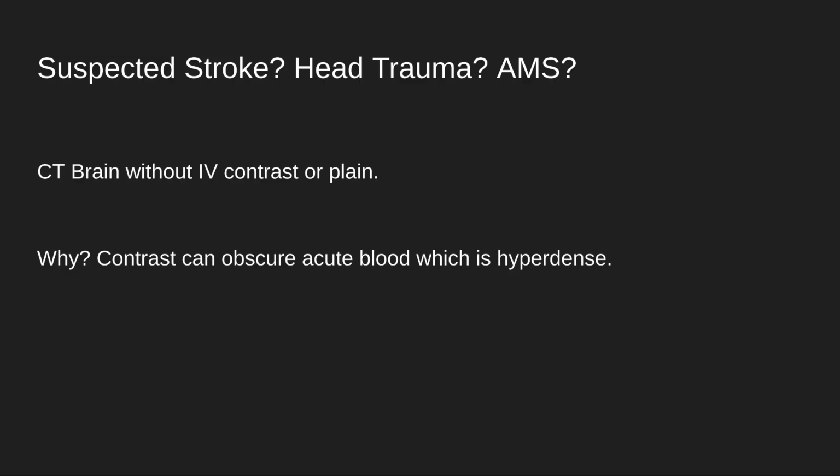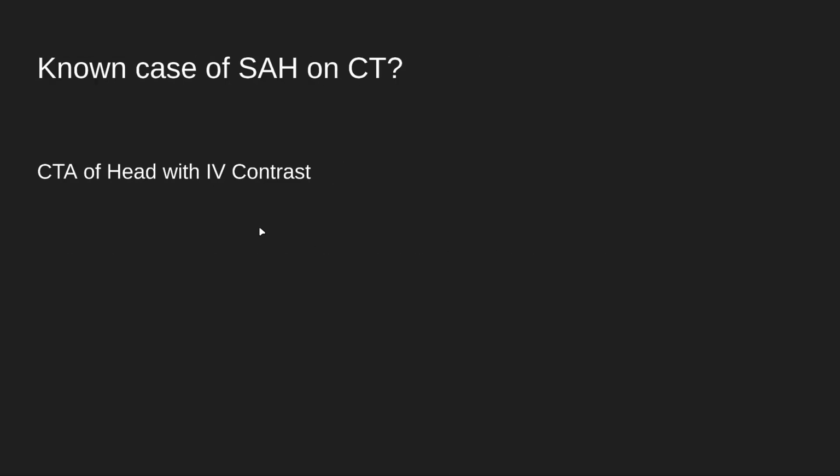Always and forever. And of course, if you have a known case of subarachnoid hemorrhage, for example, on previous CT, you might instead order CT angiogram of the head with IV contrast to assess the subarachnoid hemorrhage. Is it still present or not? Now, what about other cases?